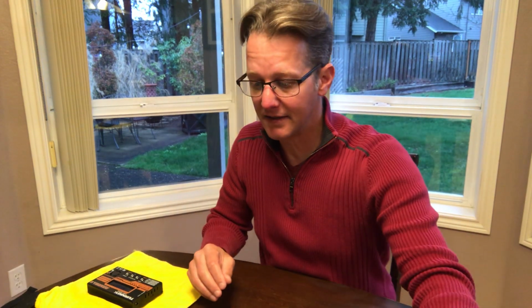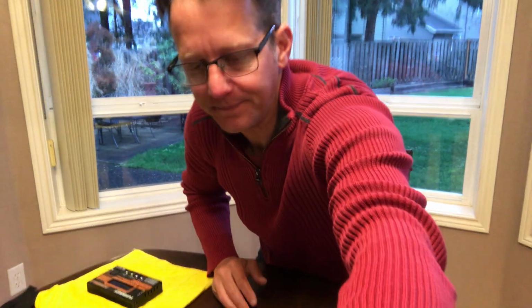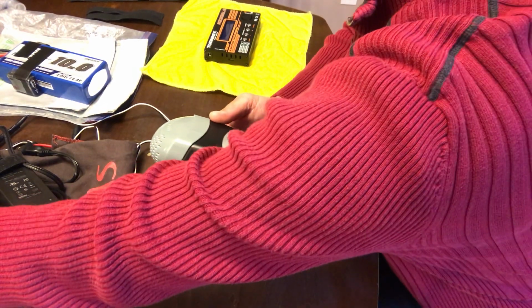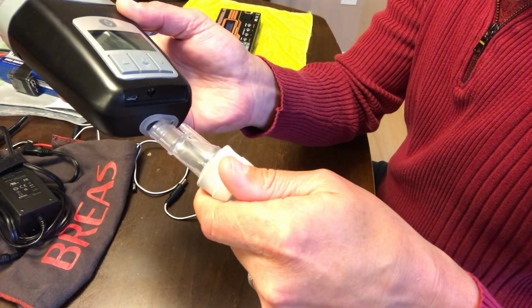So I spent a lot of time trying to figure out the voltage and everything that is needed to run that thing, and I've got everything laid out here so that we can take a look. So first, let's get a little view. You've got this little unit called the Z1, and basically how this works, you're going to plug this little adapter on the end into here.